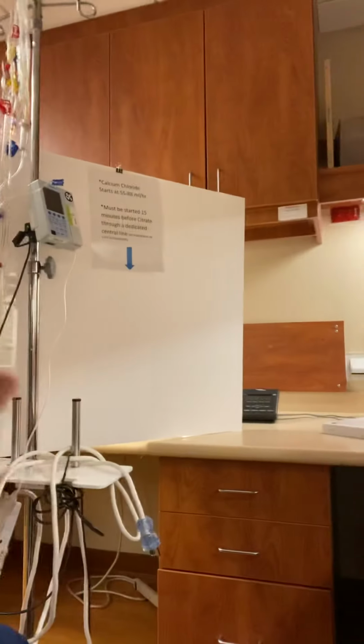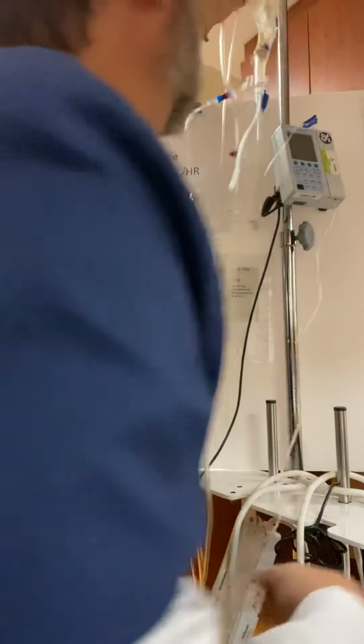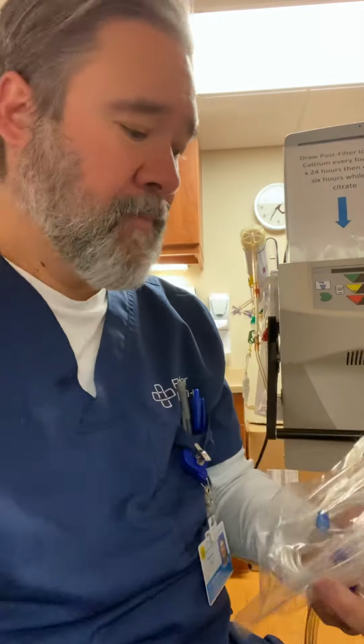Okay, so we got our citrate. We have our citrate drip, and the citrate comes. It attaches to our CRT line. So if you remember, I've asked people to keep the little blue caps that come with the CRT.